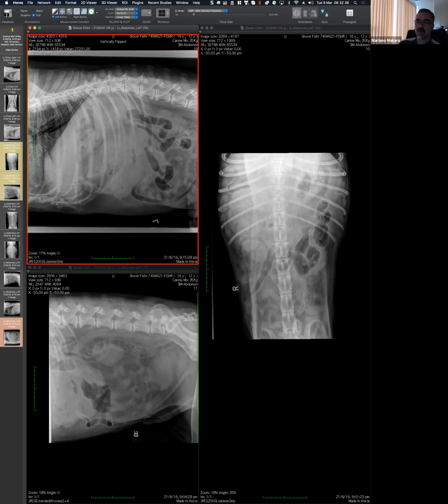And most of the people buying this equipment, because it's so expensive, are going to say, no, no, no, fix it there. I don't want anyone being able to remove this from the table. And I think that's the way that we have it. I completely understand the point, but this is limiting the ability to play with the cassette. Or not the cassette, it's the detector, the plate.